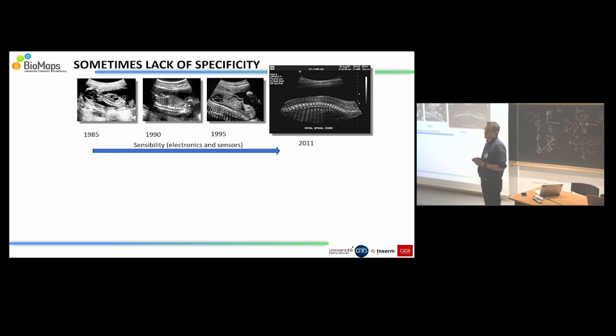We can do that, but not like I just showed you here, because here we just listen at one point. But later in the presentation, you will see that when we use plane waves, we can have a distribution of the speeds that propagate into vessels. And it's possible to find the Gaussian distribution of the blood speeds that propagate into vessels. It's not a problem, but I will show you that a little bit later.